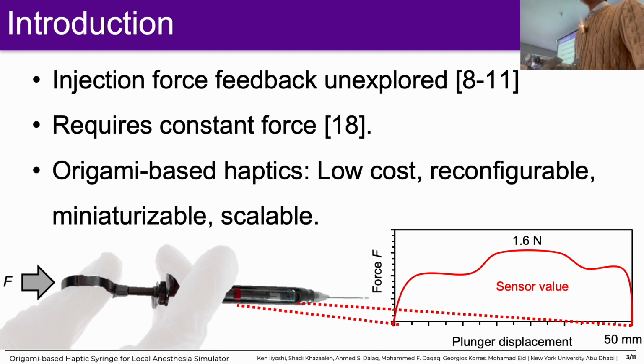Virtual reality and haptics in medical simulation has long been a very hot topic. In our lab, we primarily focus on dental simulations, a few tasks, but one that we looked into in particular was this activity where you have a local anesthetic injected into the back of your teeth. It's called the inferior alveolar nerve block procedure. You basically try to inject a nerve in the back of your gum.